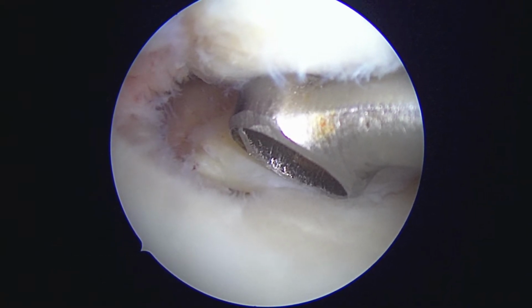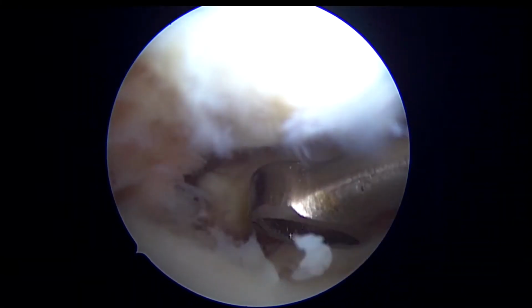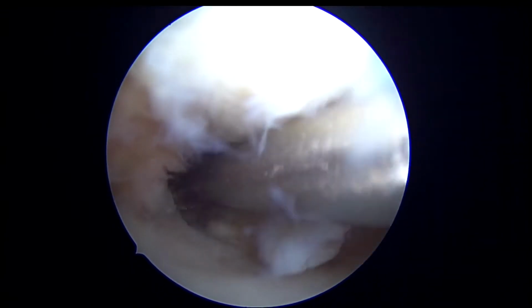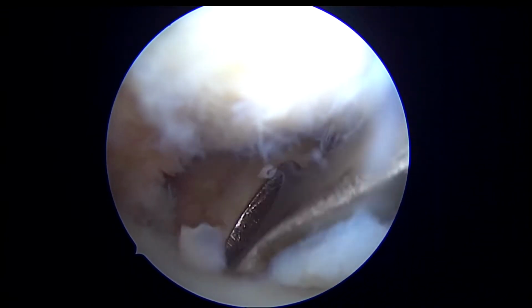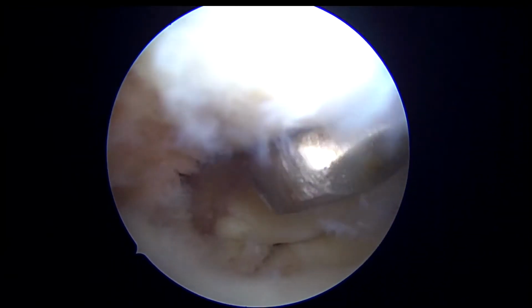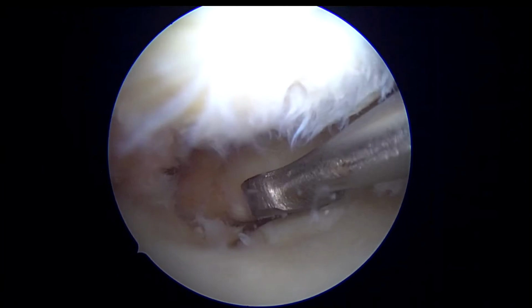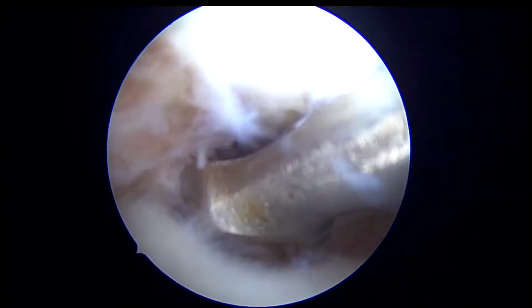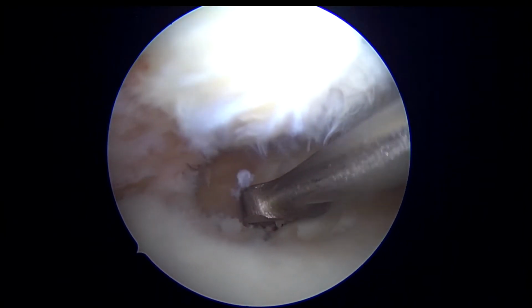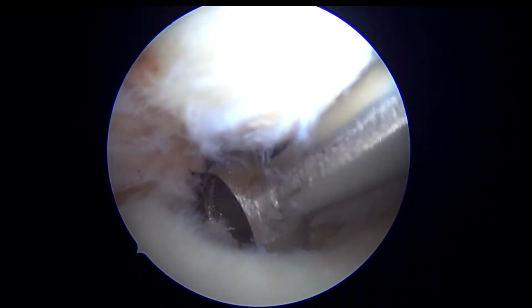tear. So to start with, for the repair, we start doing the curettage and preparing the bed for the repair with a ring curette or with a tooth curette. We need to remove the cartilage from the root area, and there should be a bleeding bone for enough of the bone marrow to come in and allow healing.